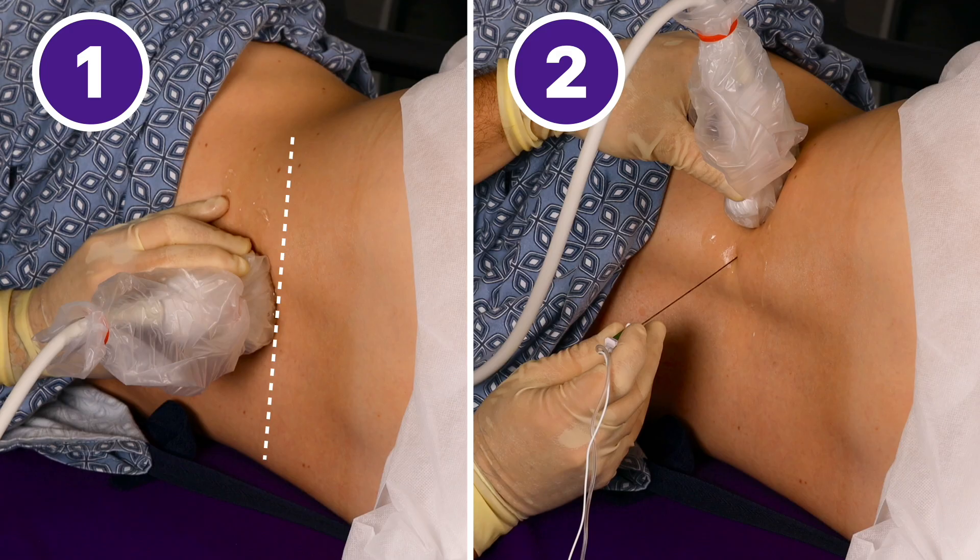To image the lumbar plexus, we place the patient in a lateral position. We palpate the iliac crest and imagine a line drawn between them. A curvilinear probe is placed in the transverse orientation over the midline of the back on top of that line. We then follow the bony anatomy laterally, aiming the beam toward the vertebra at all times, until we're visualizing the transverse process sticking up in the paraspinal muscles. The needle will come in from the medial aspect.